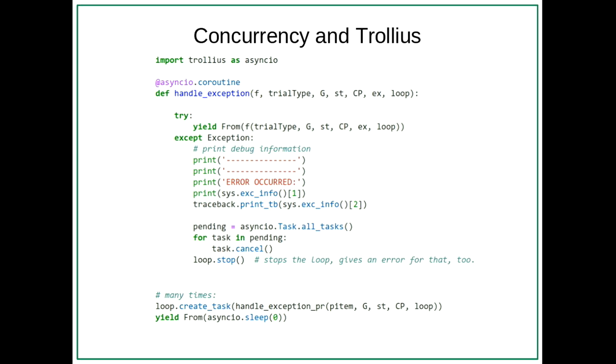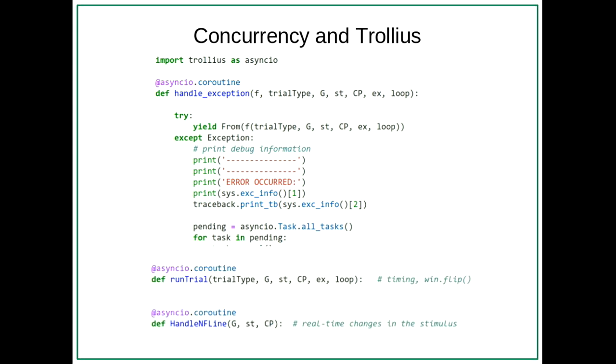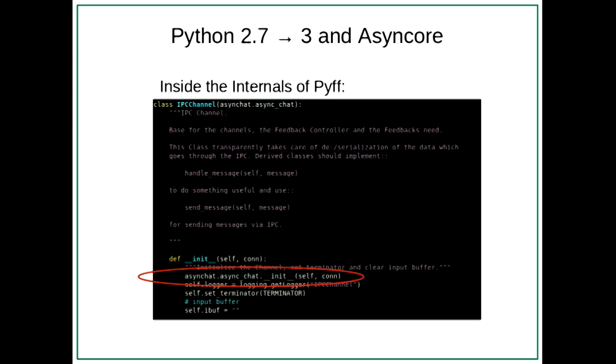So I made my own crash and burn protocol or methods, so that everything goes through the methods, and if something fails, your loop crashes and uses a print statement to say error. In terms of Asyncore, network traffic is done with Asyncore, and this is a library that I don't understand. I want to convert it at some point, but if anyone has any helpful hints with that, then please let me know after the talk.